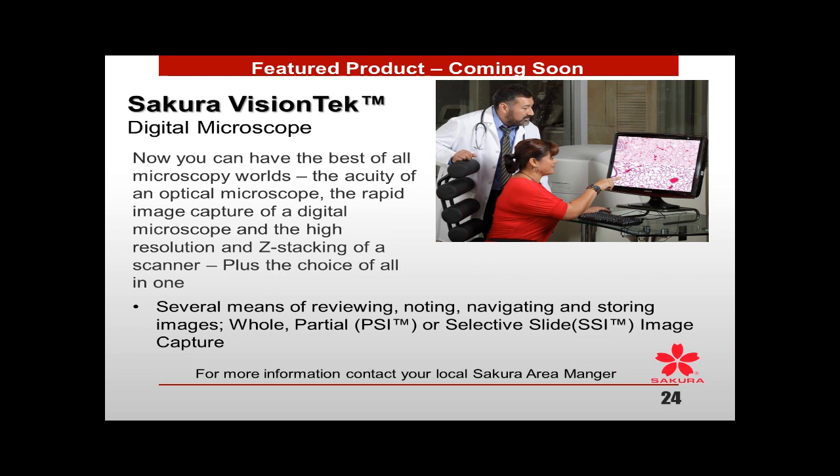First starts with the digital scanning software, and then how that software can be integrated into the report, your normal AP or your LI or your hospital reporting software. There can be limitations. Not all software will allow a lot of digital addition of the digital images into your reporting software. I think most now. But all of that really starts with the digital scan software and how easily they'll allow the pathologist to do that.